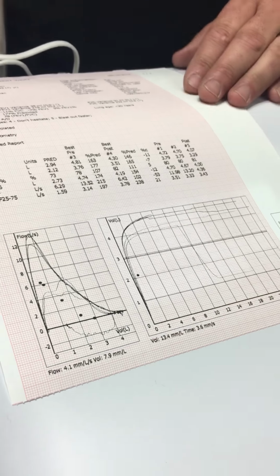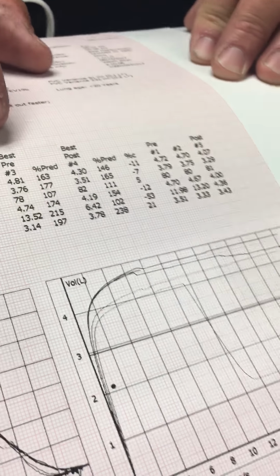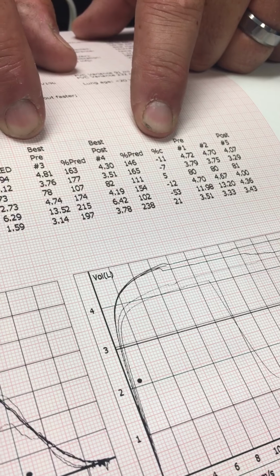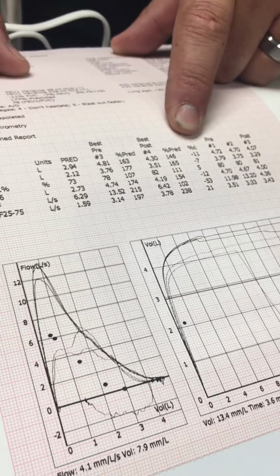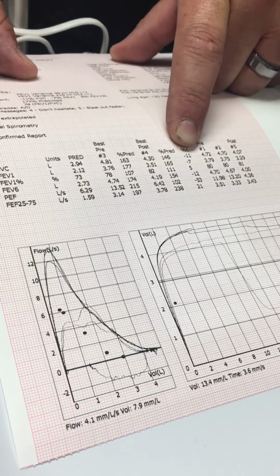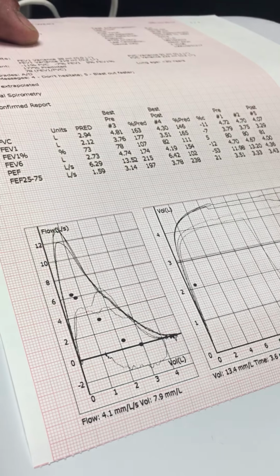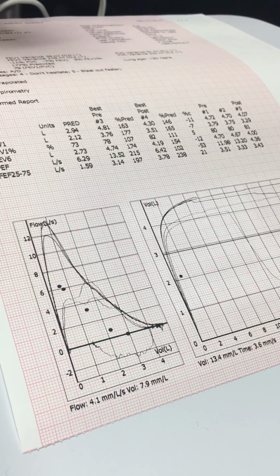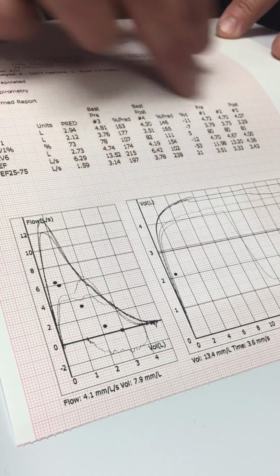Okay. Now, when we come down here, we've got our best pre and our best post. This is the percent change. This is an important number. So after you gave me the medicine, my lungs got 11% worse, 7% worse, 12% worse, 5% better. So my medicine that you gave to help me is hurting me. Change my med. Okay? So that's a little bit about spirometry down there.